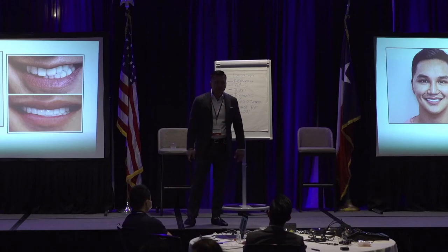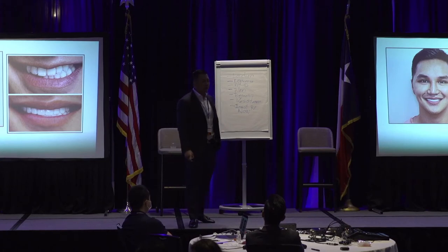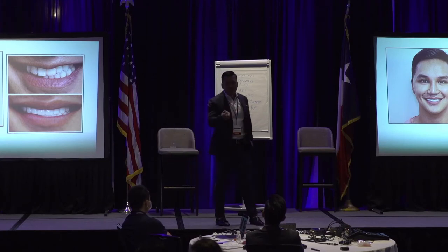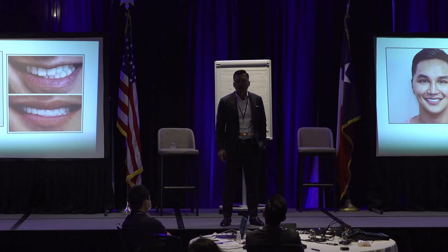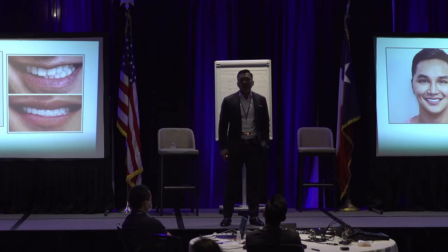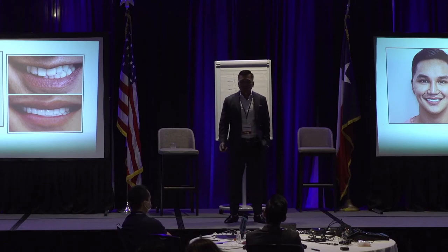I'm skipping a lot of these steps because the two-day course talks about it. I'm probably going to run out of time. But you're going to make a clear suck down on the ideal wax up. And then on your preps, you're going to put two holes, one at the gingival third and one at the middle third of the tooth, because you want to have a millimeter clearance if you're doing Emax, or half a millimeter for veneers, or 0.7, whatever you want to do. And so that clear stent is going to go over your preps, and you can measure if you have enough reduction. And you're going to have that on your ideal wax up or the final wax up that the patient already accepted. That makes sense?